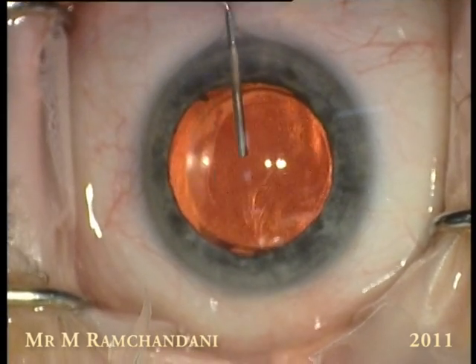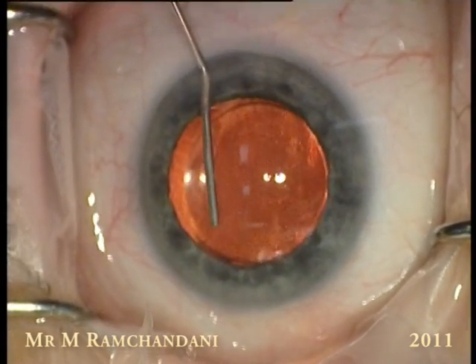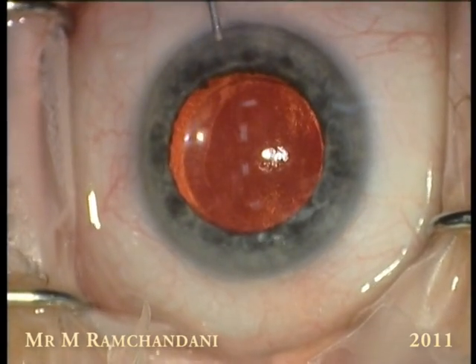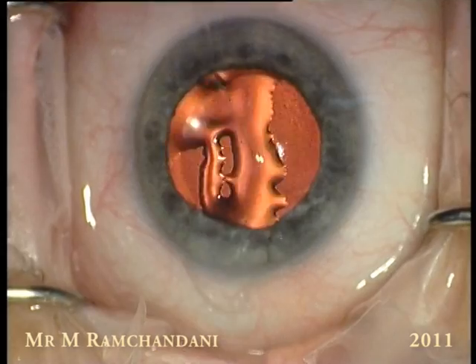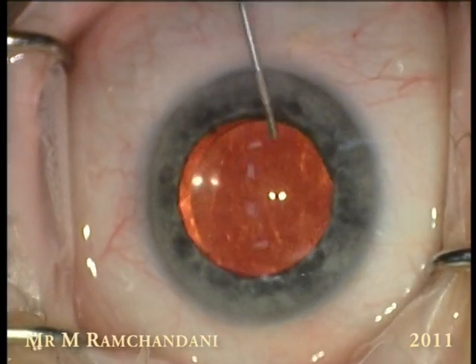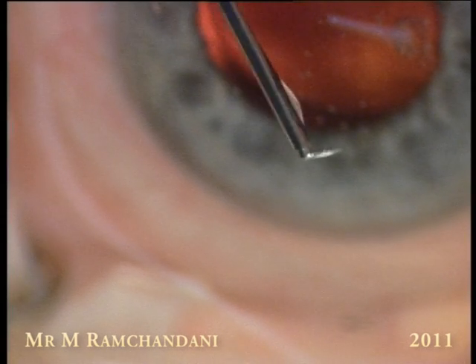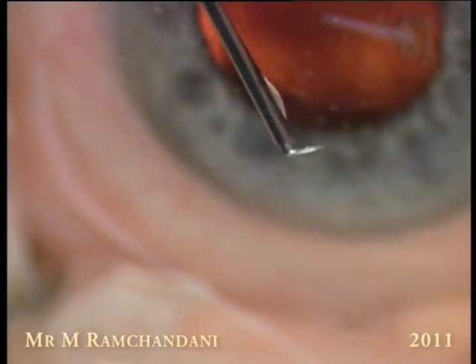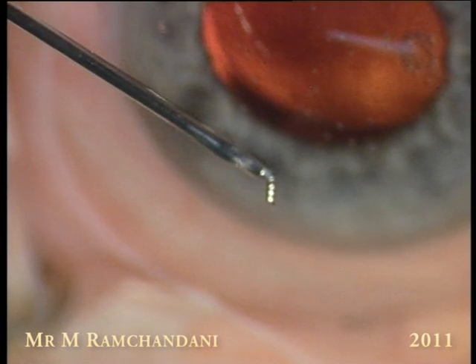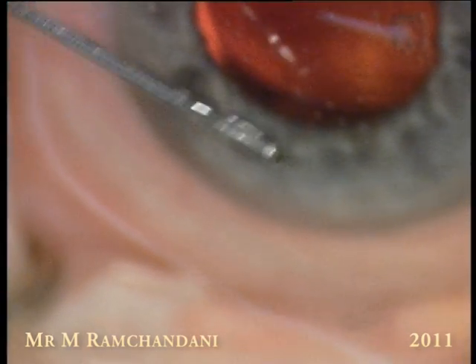At the end of routine cataract surgery, the eye is prepared by constricting the pupil. The same incision is used to insert the eye stent as is used for the cataract operation. The stent is L-shaped. The long tube inserts into Schlem's canal, and the short snorkel end projects into the anterior chamber, the front part of the eye.